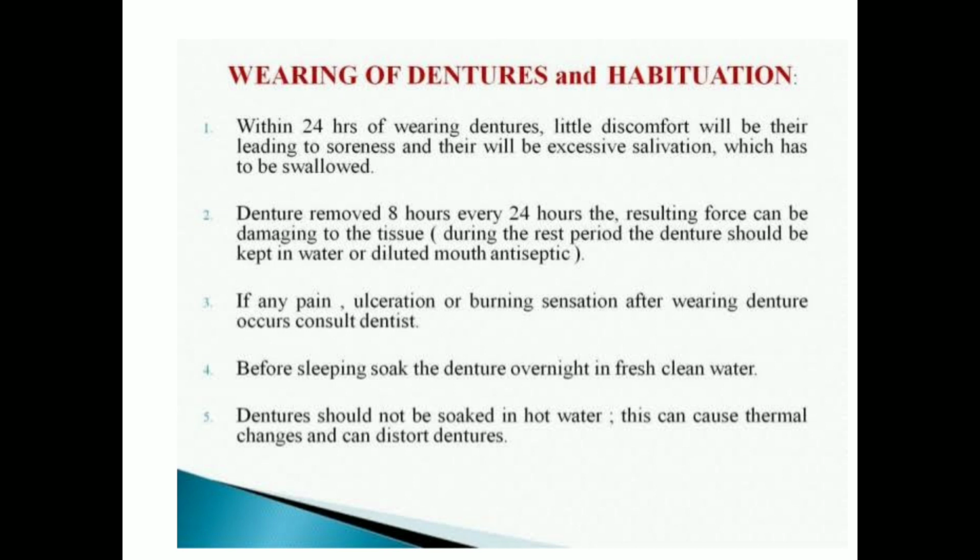Right? Initially, ask the patient to wear it for a little less time, that means for fewer hours. Ask him to wear it 3 hours, 4 hours, or if he is comfortable, 8 hours. Don't ask him to wear it for more than 8 hours on the first day, second day, and third day.